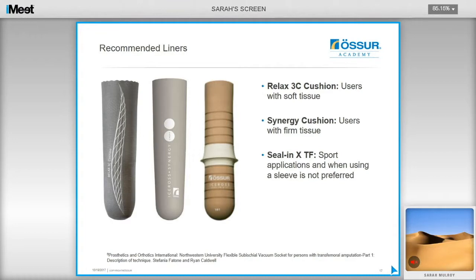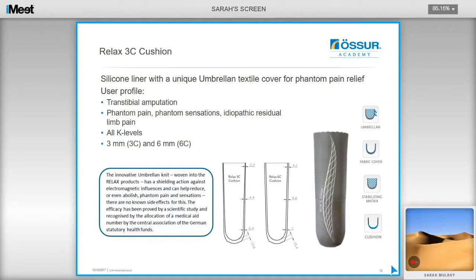There are three liners recommended for this technique. Ryan recommends the Relax 3C cushion for users with very soft tissue. The Synergy cushion liner is recommended for users with firm tissue. The Seal-in XTF can be utilized for sport applications and when using a sleeve is not preferred. The Relax 3C is a stiffer silicone than the Synergy liner and has a unique umbrella textile cover that helps with phantom pain relief, as the fabric has a shielding action against electromagnetic influences, found to reduce or abolish phantom limb pain and sensation.